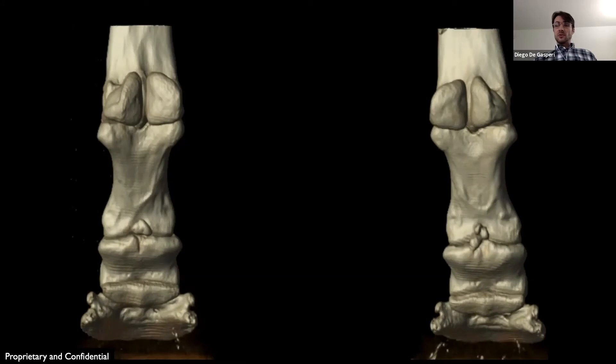Arthroscopy was performed in the palmar pouch on the right front pastern joint, and two of these three large bone fragments were identified. We were able to visualize only two of those fragments. Debridement was performed, and the horse did very well after surgery. Now he's back in training and sound.